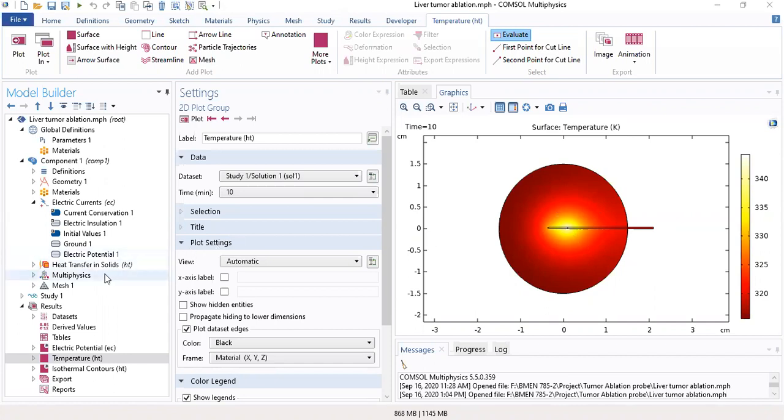And we will be using the Joule Heating Module in COMSOL to apply electrical current that gets converted to heat by the resistance in the probe to cause tissue damage based on heating in a tumor.